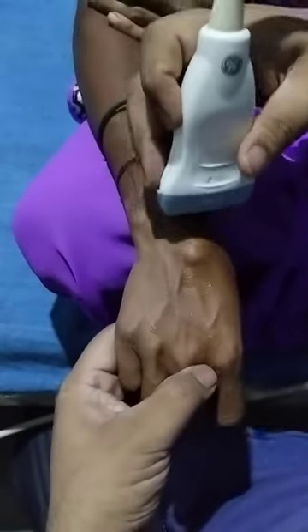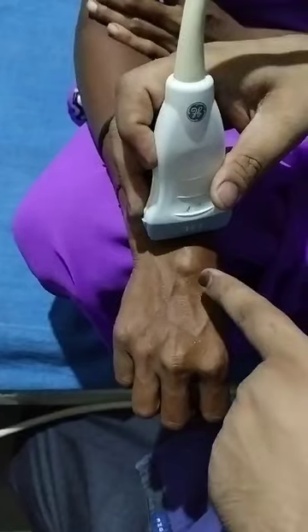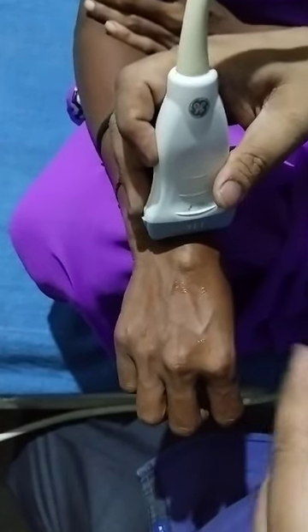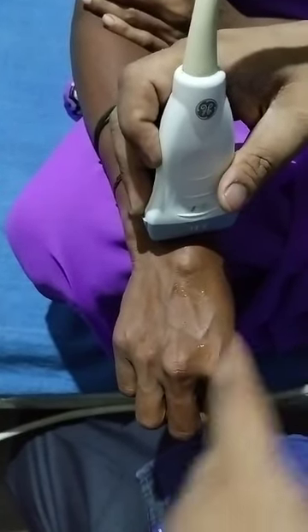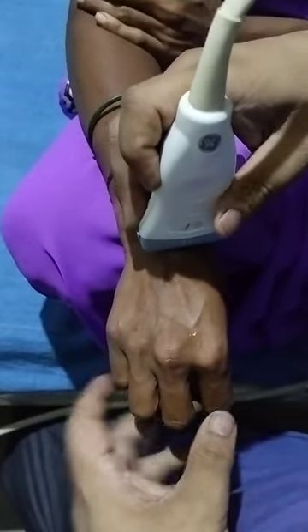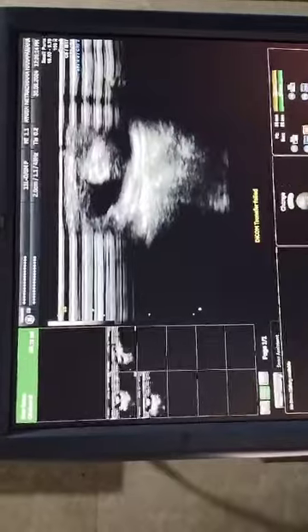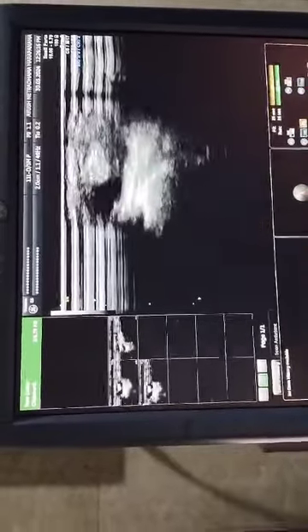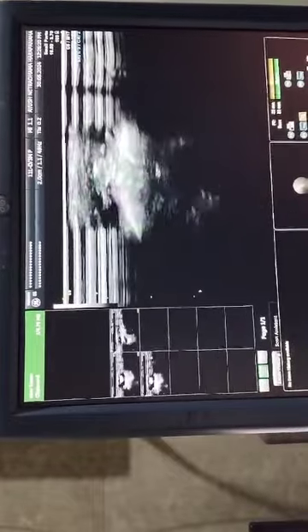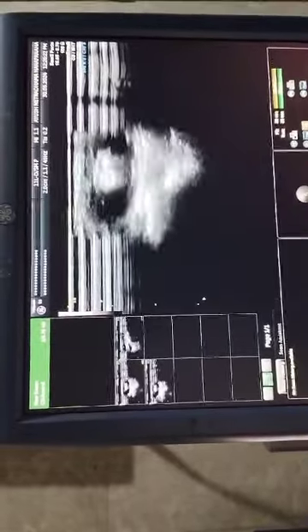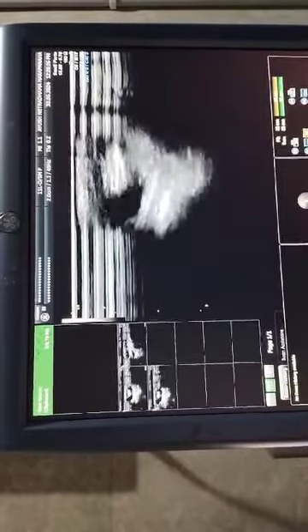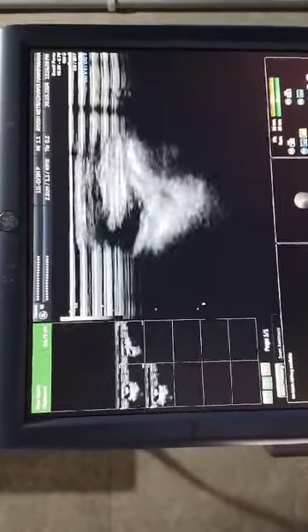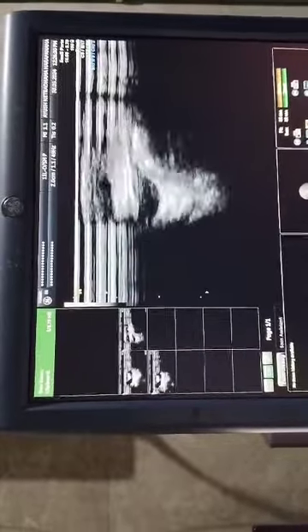And this is the clinical location of the swelling. See the extensor index finger tendon surrounded by fluid and tenosynovitis. This is not a ganglion cyst. So this is how we differentiate tenosynovitis from a ganglion cyst.